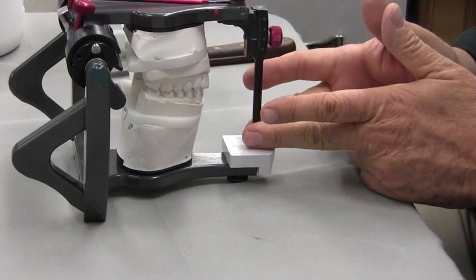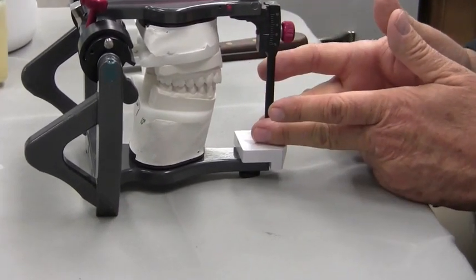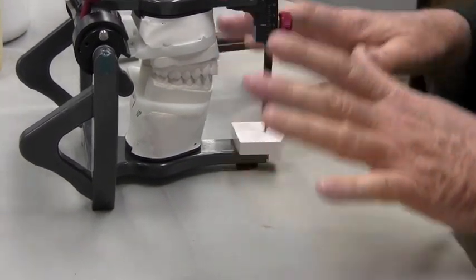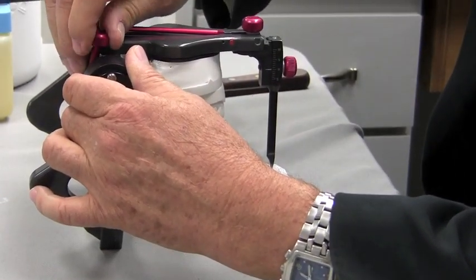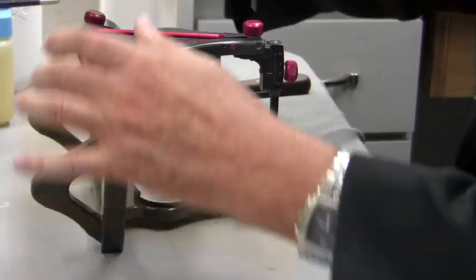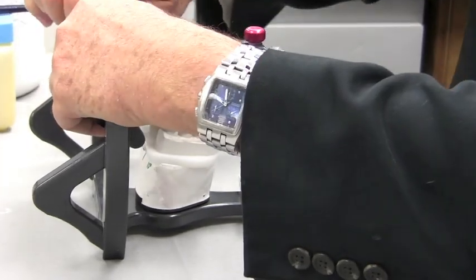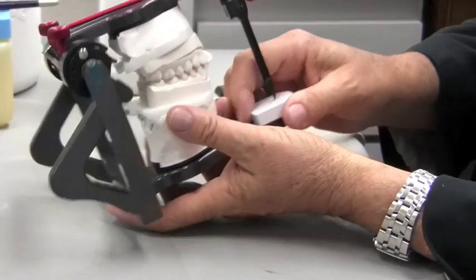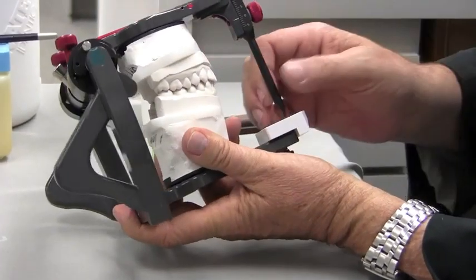This anterior determiner pin, which by the way is something you really should have to make these, allows us to make them much more easily and much more accurately. The things we want to verify before we start is that we indeed have our condylar guidance set at our preferred setting, which is 25 degrees. Once we have it set there, we want to look at our function and make sure that we are indeed seeing cuspid guidance and that we have no balancing interferences.